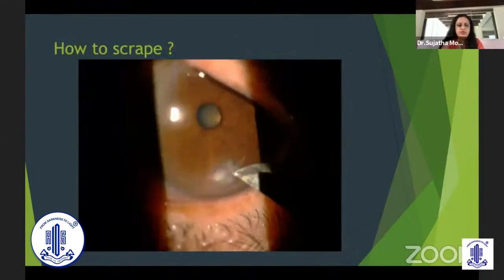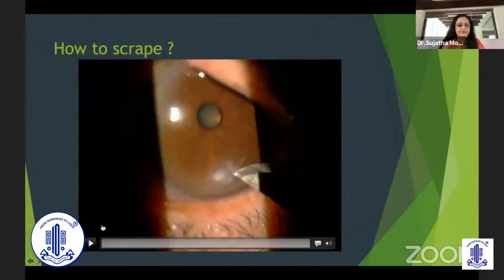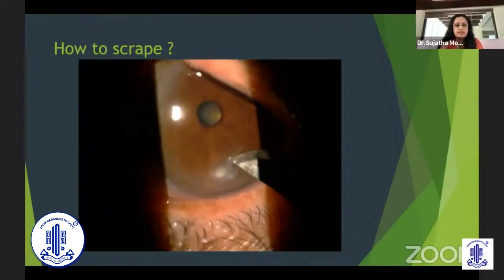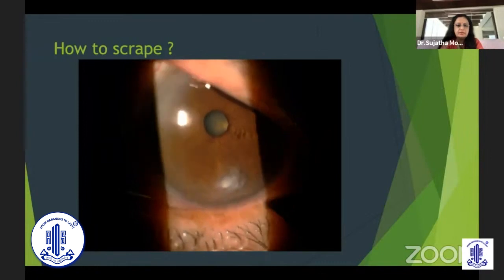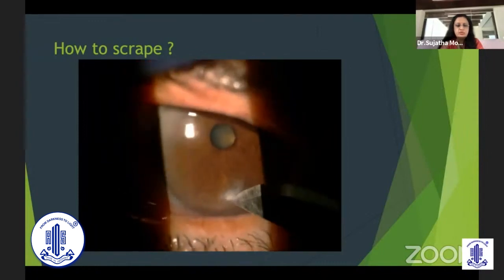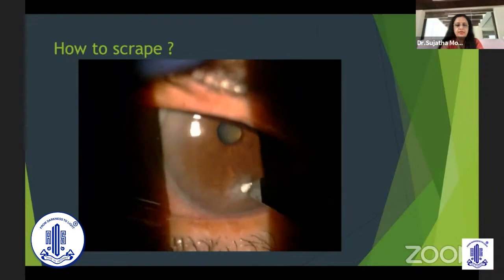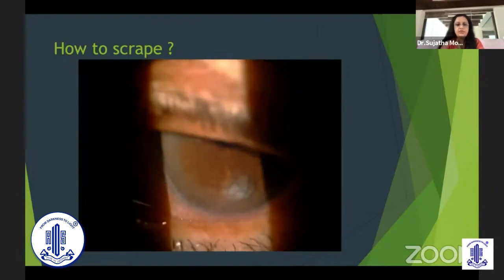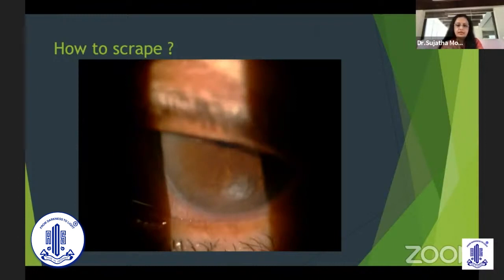This is a small video showing how scraping is done. It's always important to use the same direction. You can see scraping of the periphery, using another blade to take the next site for inoculation. It's important not to use the same blade as you may re-inoculate or accidentally inoculate another area. Scrape in the same direction; don't use multiple directions, and always scrape the active edge of the ulcer.